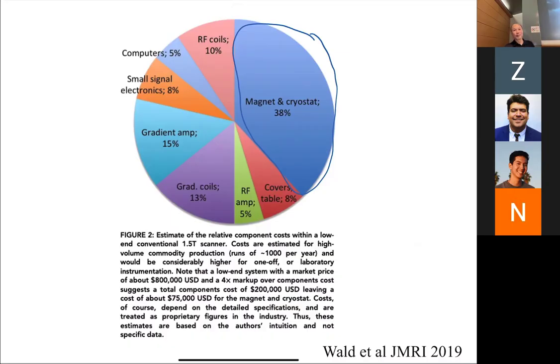Yeah, so like prefabricated magnets, they sell prefabricated ones by the entire group. Well, you can get them in a trailer. If someday you want to get your own MRI system, then you can buy in trailers. In fact, here at UCSD, sometimes when there's a need for more MRIs but there's no building to put them in, they'll just rent a trailer. And so the manufacturers have figured that out.